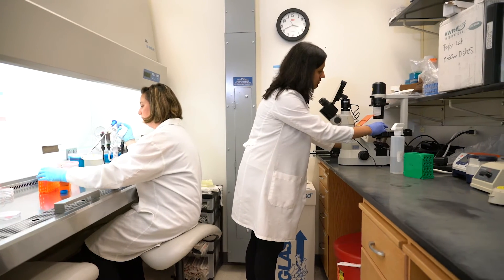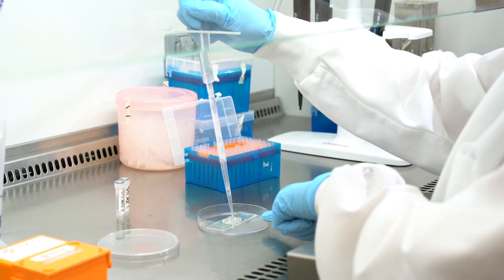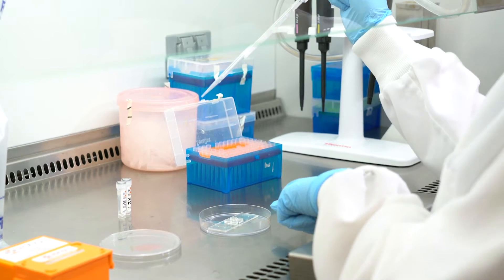Every time I've used it, the cells come out the exact same way given the same conditions, and it's a really easy, simple thing to use. We have used it for both stem cells and primary cells and have had excellent results.